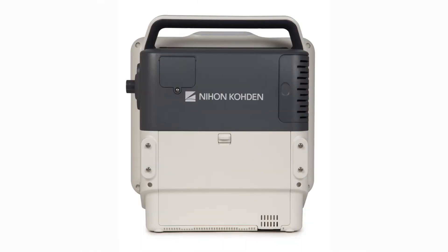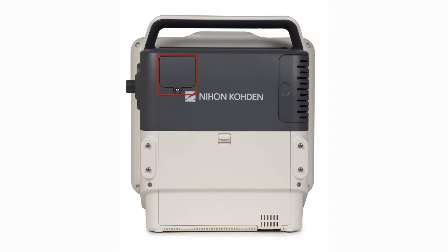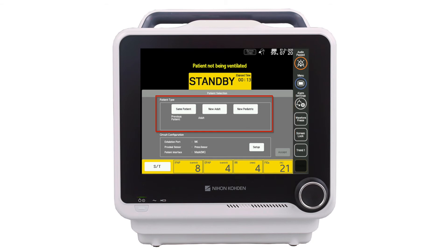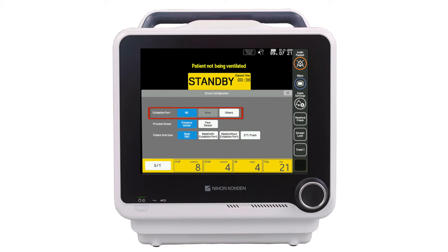On the rear of the ventilator is the main battery compartment, which contains a hot-swap lithium ion battery, and the oxygen sensor compartment. When the ventilator is powered on, the patient selection window will be displayed and the ventilator will be in standby. In this window, the clinician selects the patient type and reviews the circuit configuration. To change the circuit configuration, press the setup button, then select the appropriate choice for exhalation port, proximal sensor, and patient interface. To close the circuit configuration window, press the X.